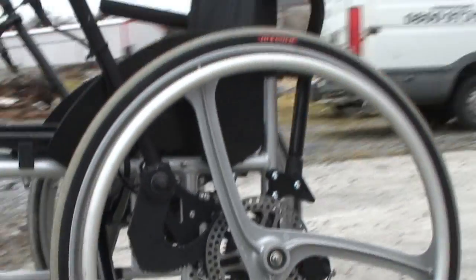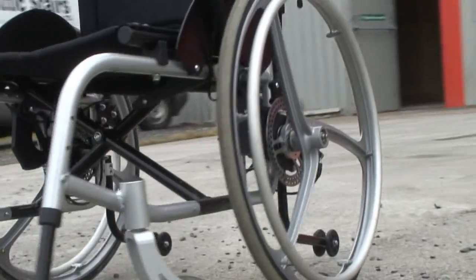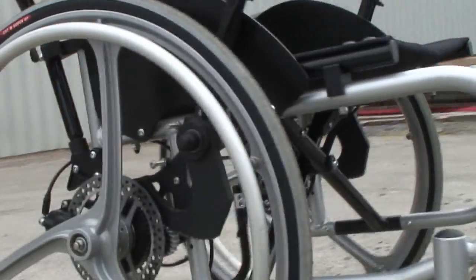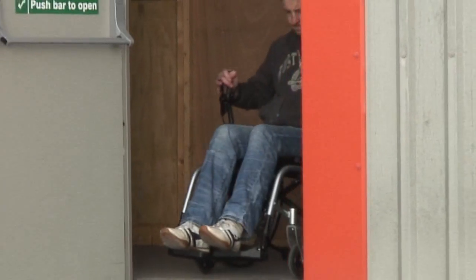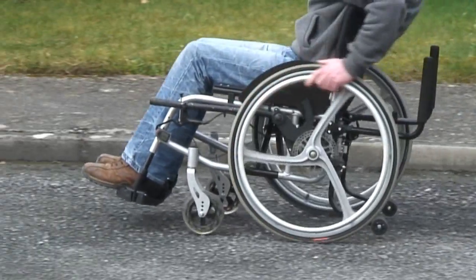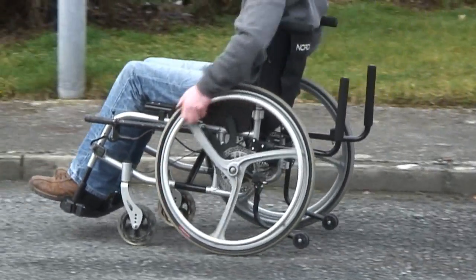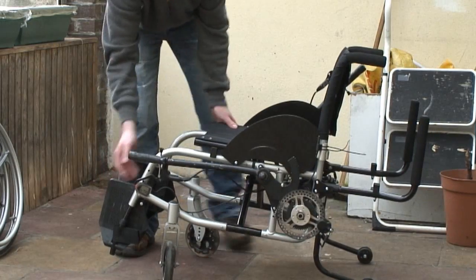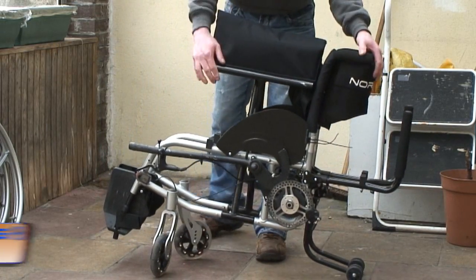The Nordigo system is attached directly to the frame of the wheelchair, giving a solid base for the system to work from. This also means the levers are inside the wheels, keeping knuckles away from potential scrapes when going through doorways. As the Nordigo uses the frame as its base rather than the wheel, the rim-based propulsion can be used at any time. Wheels remain quick release and the wheelchair can be folded down and stowed away as with any other wheelchair.